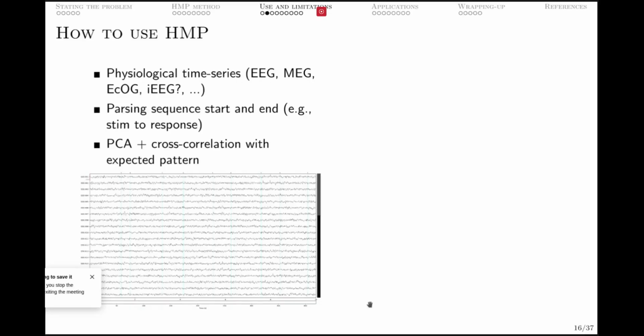So it's really only about EEG and MEG. That's for sure something that works. And what you do is that you usually have some kind of recording, as you would have in your acquisition computer. You would see one line per electrode, and you have triggers in the data, right? A trigger that gives you when the stimulus started, and a trigger that gives you the moment of the response.